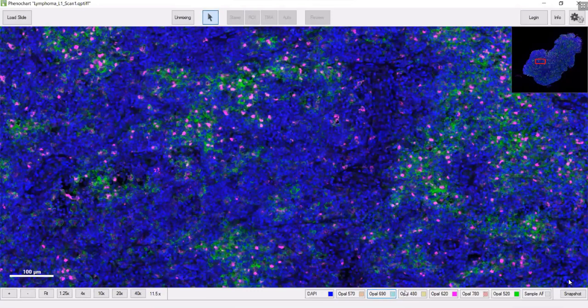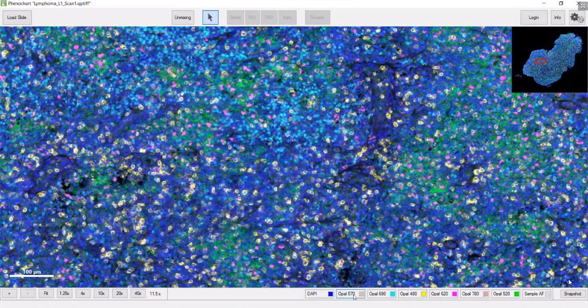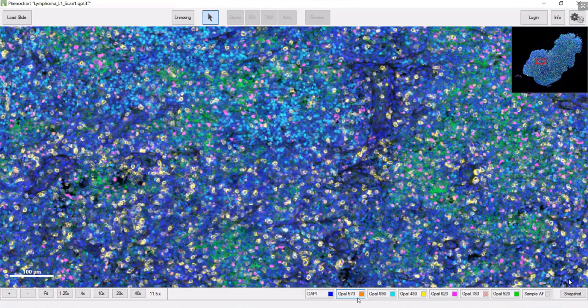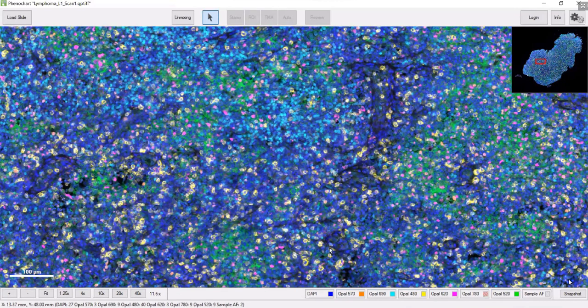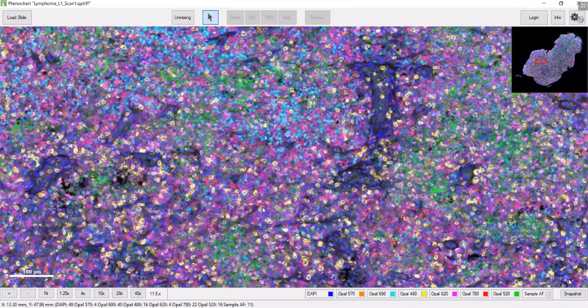If we turn on all the marked layers, you can start to see how complex this really is.